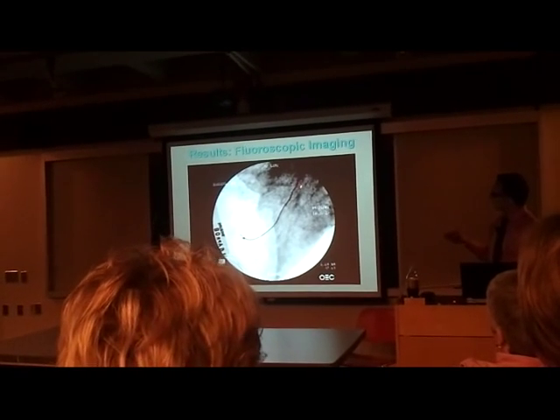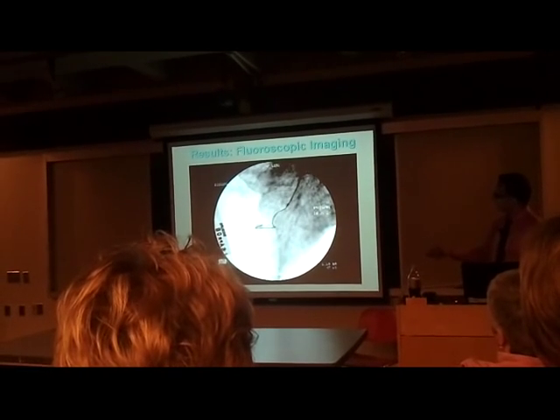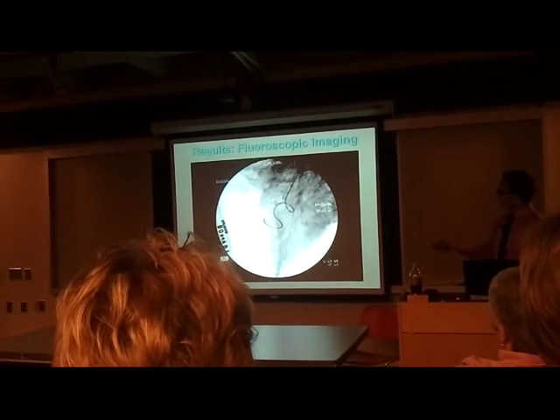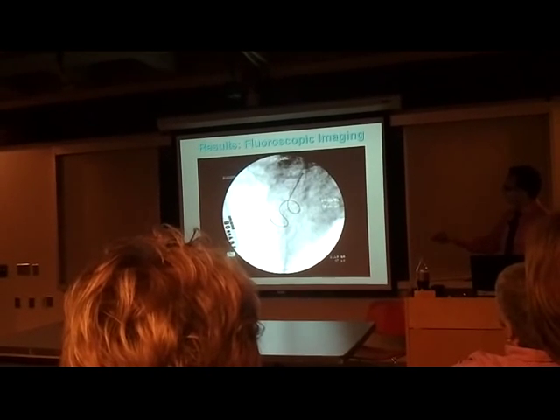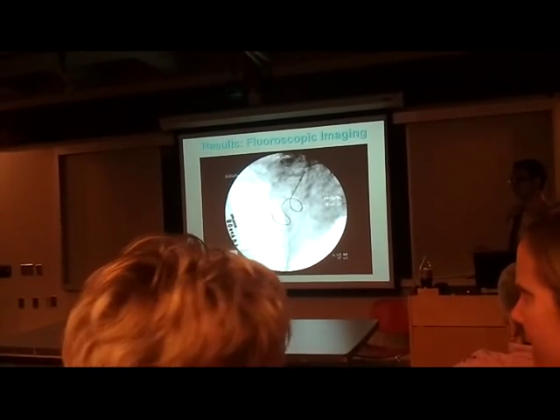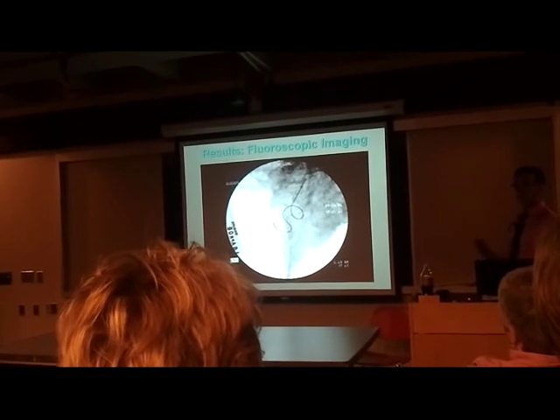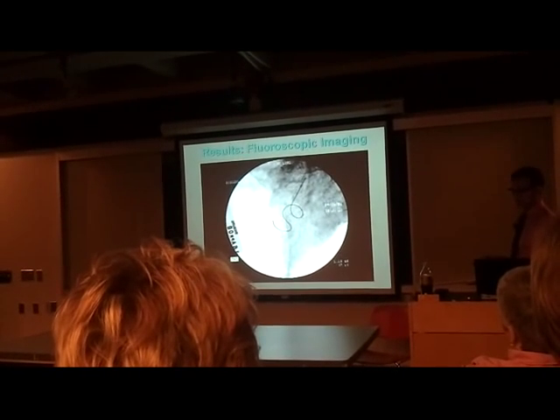So this is how it goes. Flexible bronchoscopy is being done, and you see how straight it is, and as soon as it's released, you see how it's pulling the lung. So now it has pulled the lung. The airways that were straight are now twisted, and the tortuosity has basically blocked the airflow. So it was a kind of crude way of doing it, and it worked in the animals and in some humans, but now the complication rates are high enough that we're not even starting this study in the States.